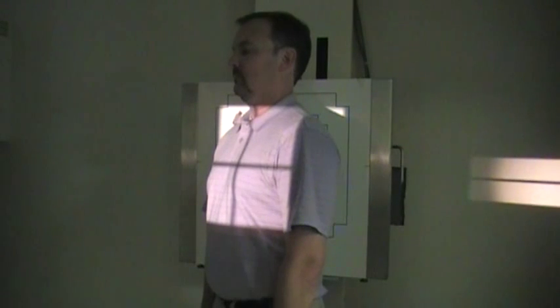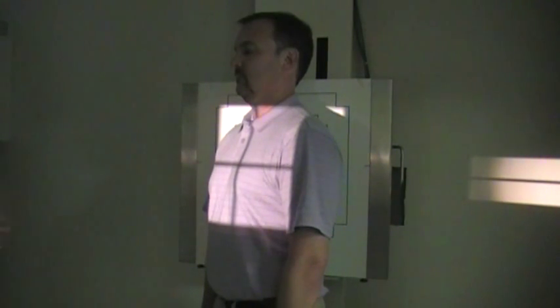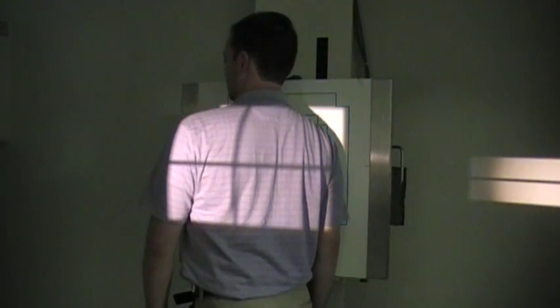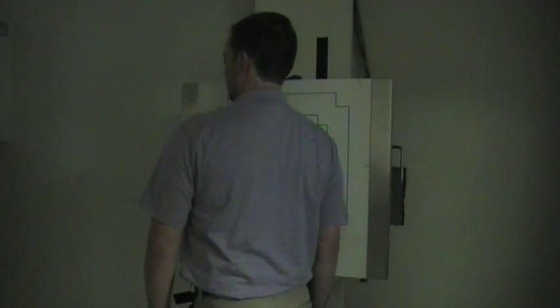So AP oblique is the more common oblique you'll be seeing. Now, it is okay to be imaging chest obliques in a PA oblique fashion. Thing to remember, just like with the rib x-ray, you're going to be marking the upside, because the upside is the lung field that you will be seeing best when you do a PA oblique. It's totally opposite than that AP oblique.